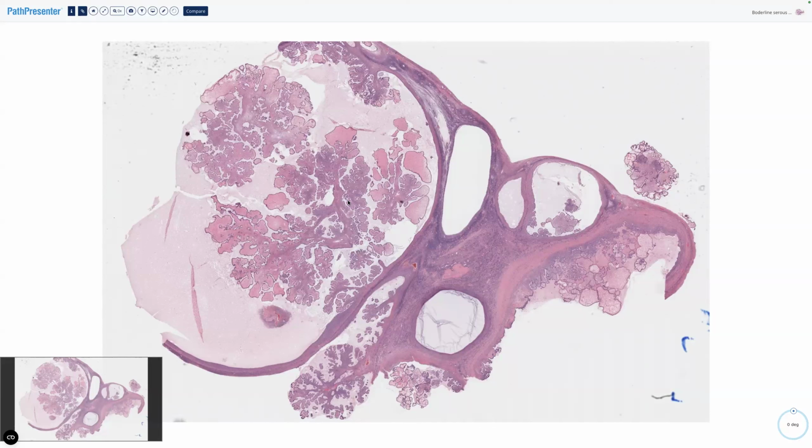So we aren't going to cover that today, but we are going to think about serous borderline tumors, which are much more common. So serous borderline tumors classically have this, what's called arborizing branching. Okay, you can see that there's stems, and then the villi get smaller and smaller. This is normal for these tumors. Okay. And so when we look at these serous borderline tumors, we want to identify poor prognostic features.